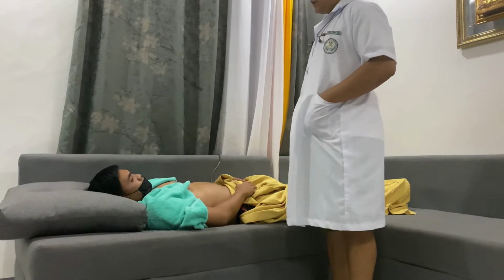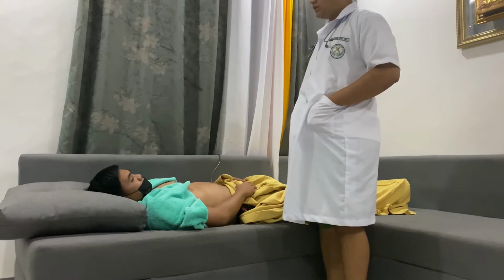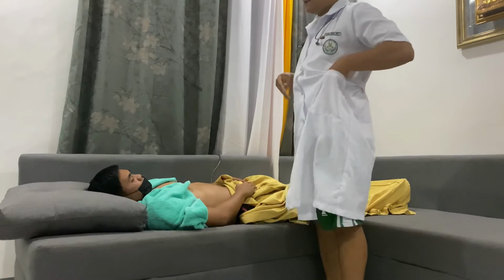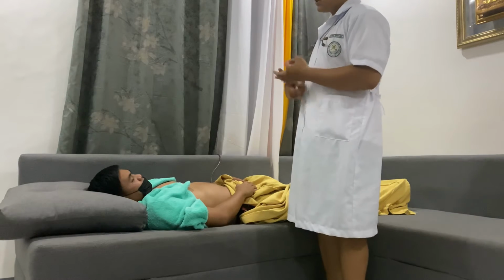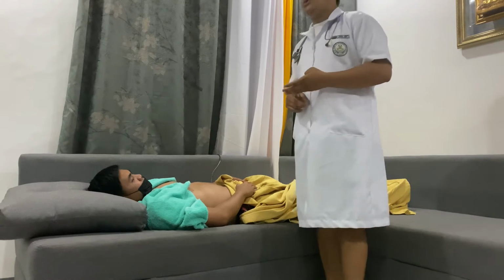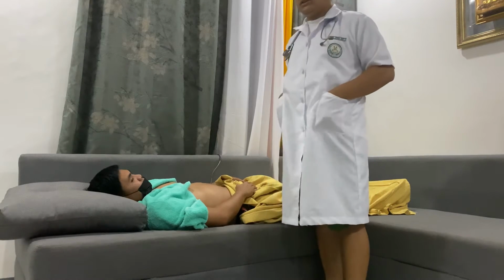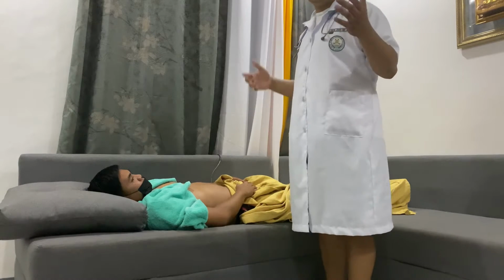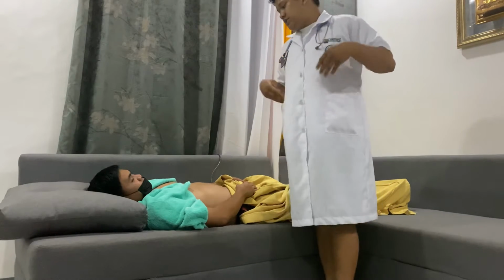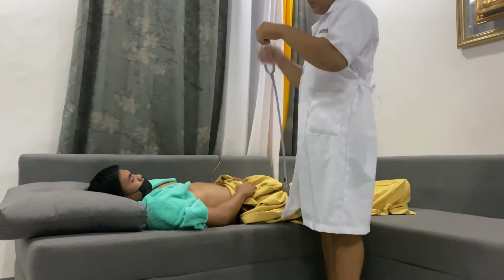So next we're going to auscultate the four anatomic sites of the heart, which are the aortic, pulmonic, tricuspid, and the apical. Before auscultating that area, we're going to eliminate all the noise in the area. So now we're going to auscultate the aortic first.